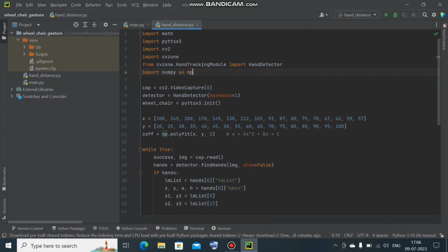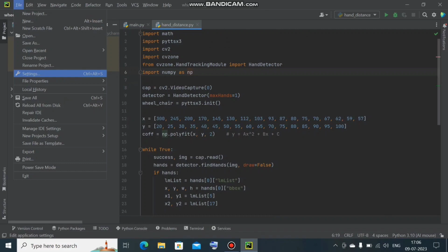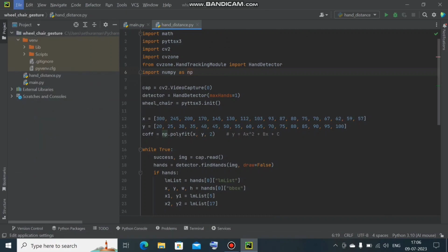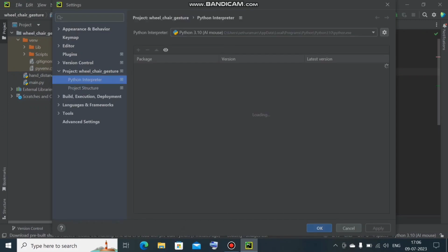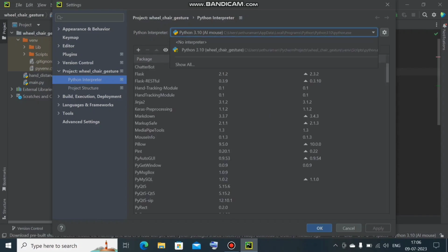So in this video, I will show you how to find the face distance from the camera. What are all the libraries we need? Go to settings, then in the project wheelchair gesture, there will be a Python interpreter. I have already added an interpreter.